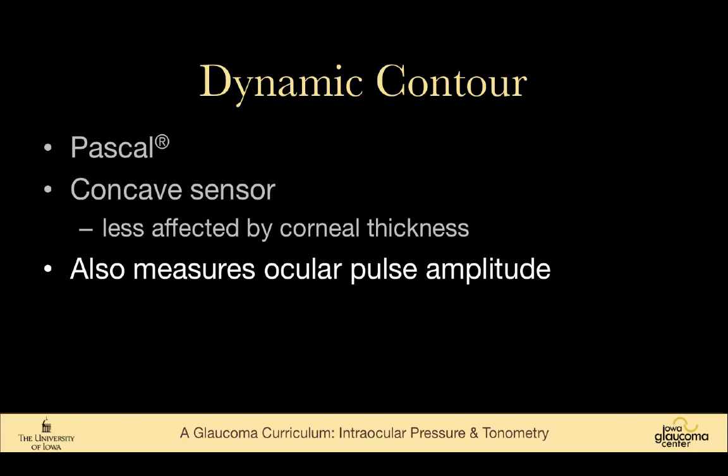It's rather expensive, and I think the reality of intraocular pressure, and this will sound heretical, is that the precise pressure is less important than the pressure in an individual. For example, if you know that somebody is getting worse at a pressure of 22 measured on a Goldmann tonometer, it really doesn't matter if their actual pressure is 24 or 20.